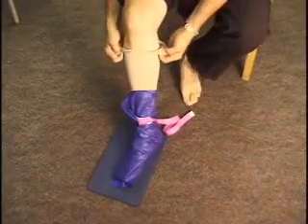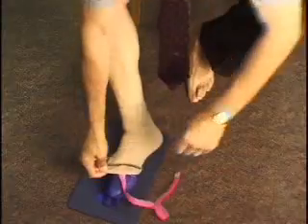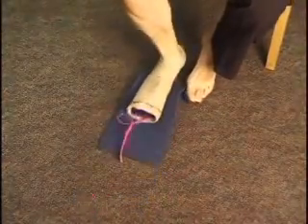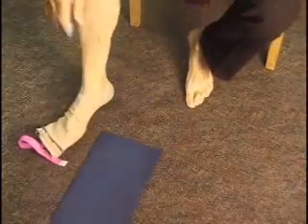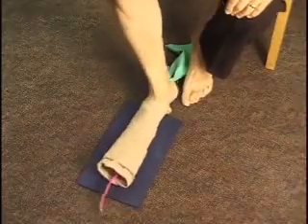This removal can be facilitated with a removal device that is placed over the stocking and then placed over the heel. It is important to use scraping motions to remove the stocking and applier. This method is often used instead of manually removing these very heavy hose.